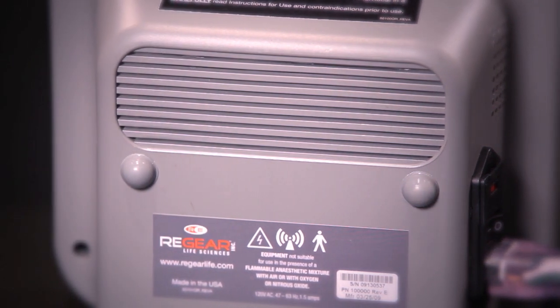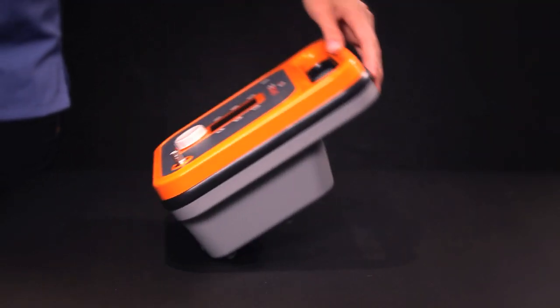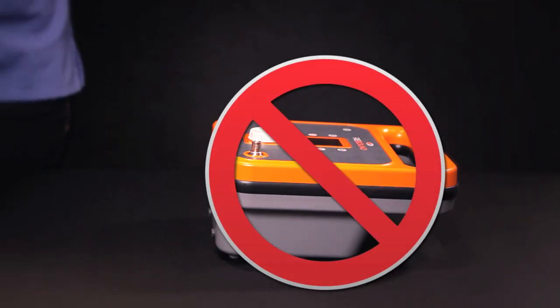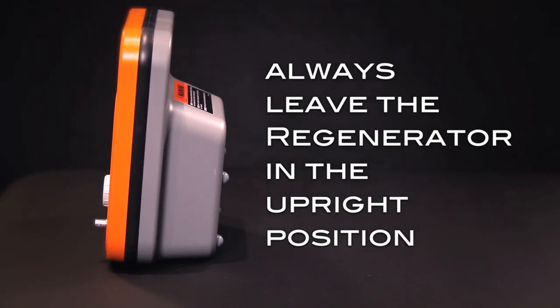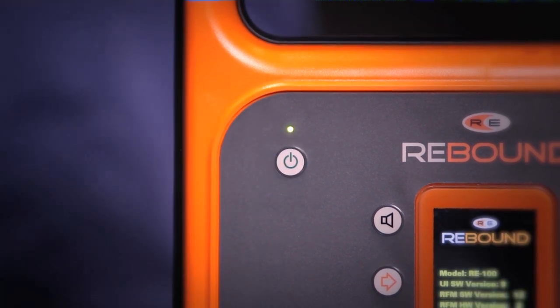The fan cools down the internal components of the Regenerator, so it's important to always leave it clear from obstructions, which could include laying the Regenerator on its back, setting it flush against the wall, or leaning it against something soft such as a pillow. The easiest thing to do is always leave the Regenerator in the upright position when it's powered on. Once running, press the soft power button to go into ready mode.